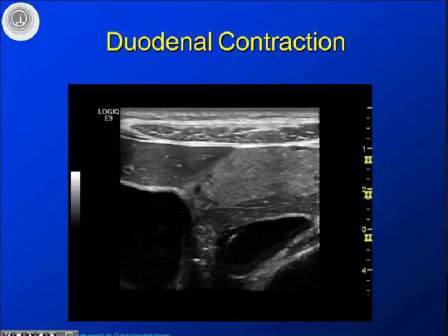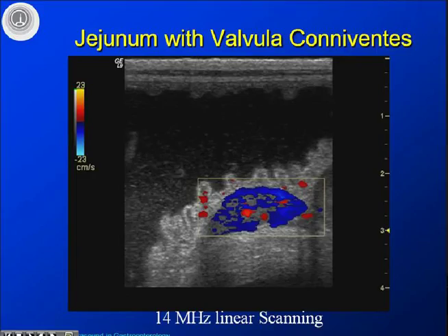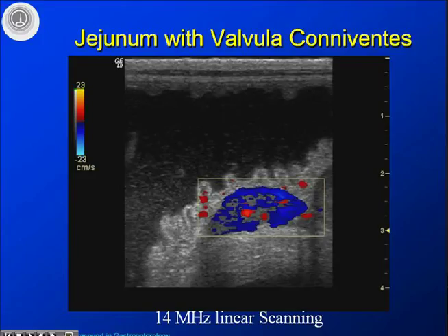This is very high-detail imaging — this is actually the pancreas. You can appreciate how the posterior part is darker than the anterior part. This is the liver and the caval vein with a valve, and this is a contracting distal part of the duodenum. Using high-frequency ultrasound you can really obtain a great degree of detail. Further down, this is the jejunum with a Doppler signal from the wall; you can appreciate how the valvulae conniventes surround the lumen, obtained with a 14 MHz linear scan — detailed imaging not possible with any other imaging modality.